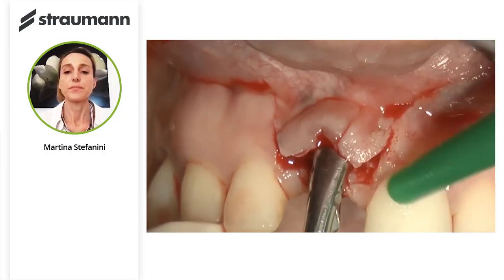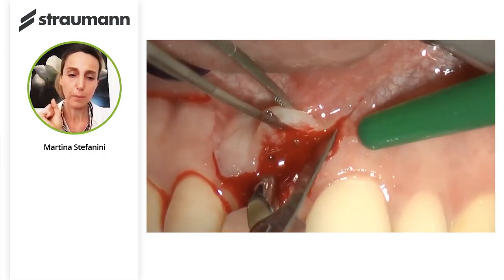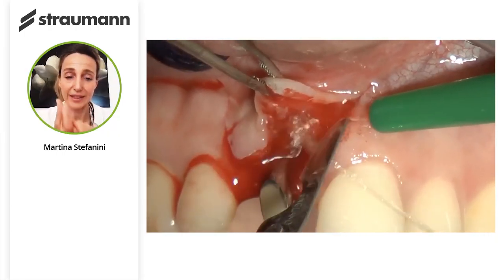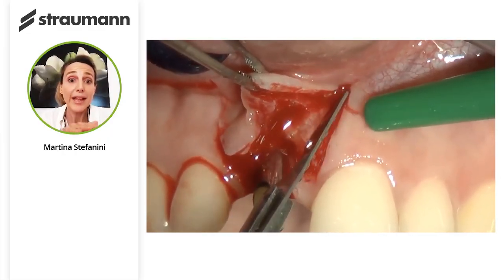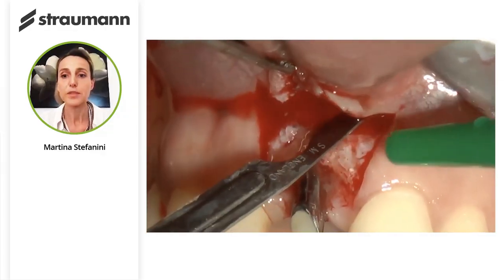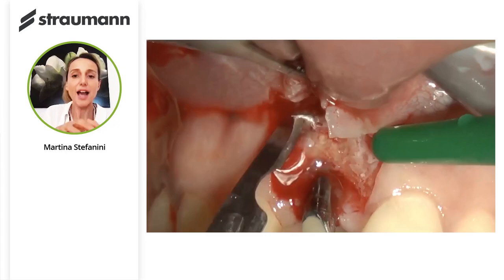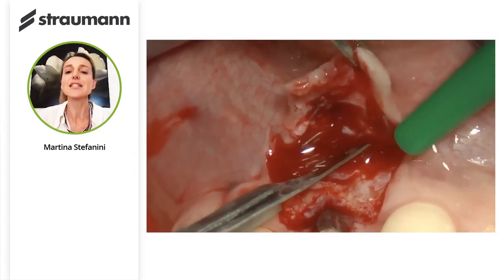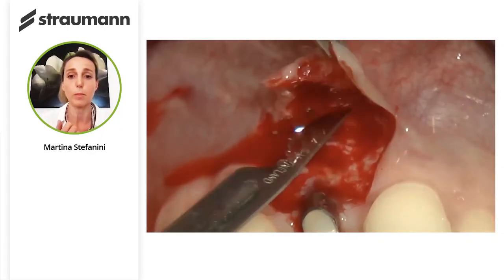Then with the periosteum elevator, you can elevate a certain portion of the flap full thickness to increase as much as possible the thickness of the flap in this area, which will be coronally advanced and will remain positioned above an avascular area. Then with the deep split thickness incision parallel to the bone, you start to detach the alveolar mucosa from the deep insertion. You see, this is the deep split thickness incision with the blade parallel to the bone.